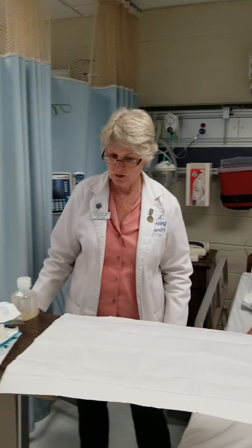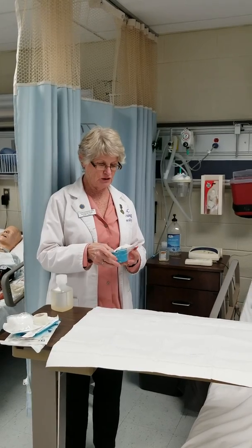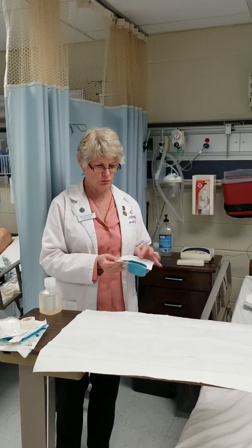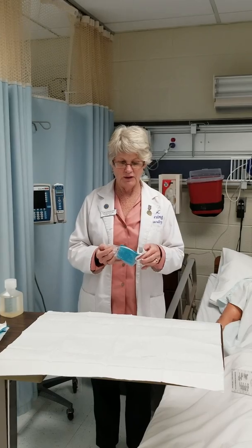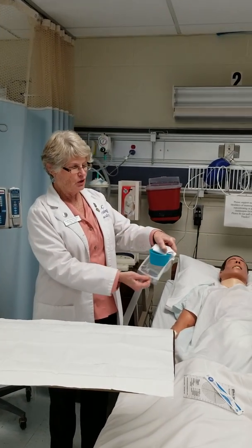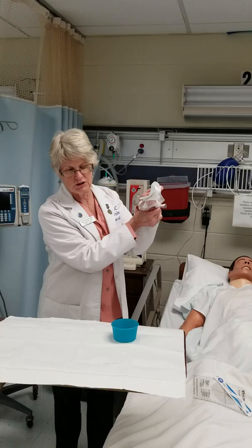Okay. Once I have my sterile field, I can start to put the other sterile pieces that I need in order to complete a dressing change. This is my sterile bowl. And again, standing away from the field, peel it open. Then I can take the sterile packaging, hold on to the bowl, lift from behind, and just drop that on the table.